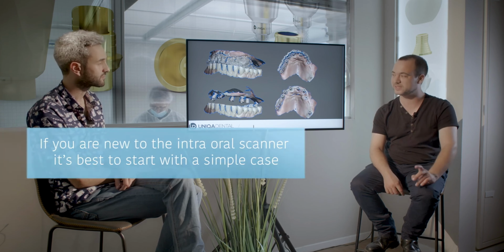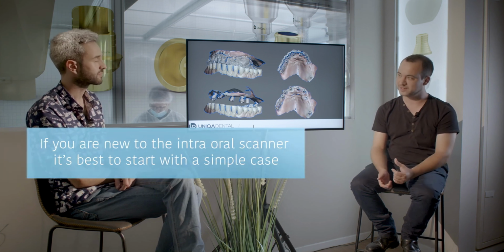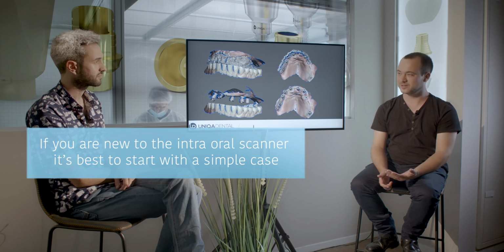So as with everything else in life, it just takes practice. You need to start small. You need to have a little bit of practice with the small works. You need to see where you have problems, and you need to know how to see those problems, because it's not visible right away, and you can scan whole jaws and everything will work when you have enough experience.